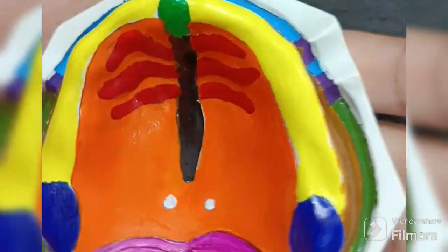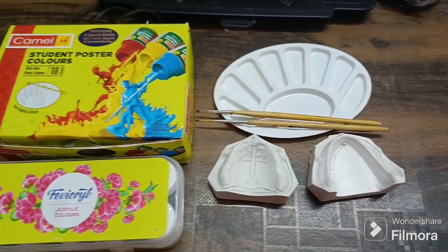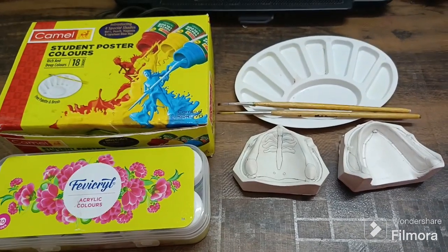What's up everybody! Today we are gonna paint this maxilla. I know that it's a bit interesting and at the same time it's time-consuming as well. Here are my drawn cast.